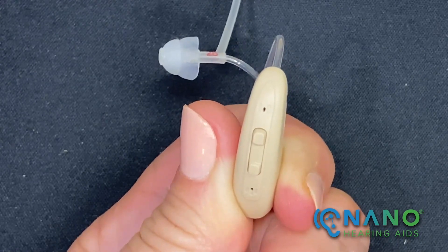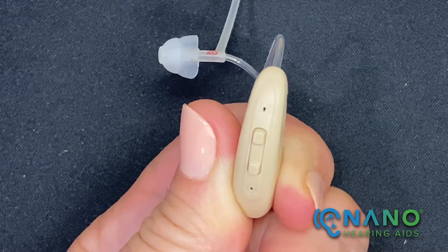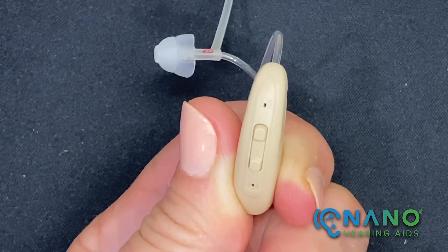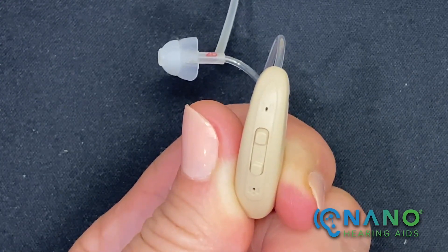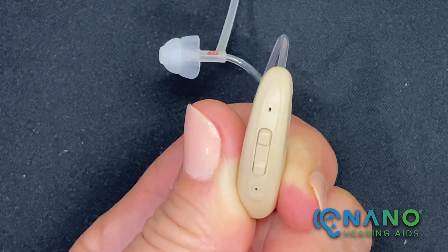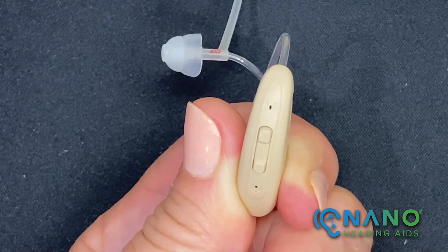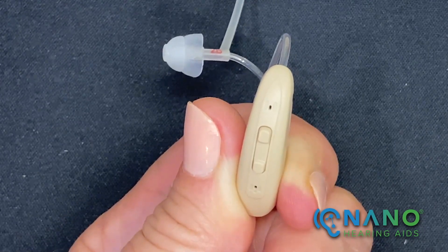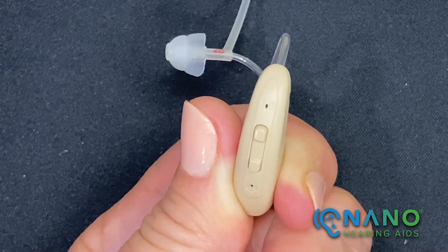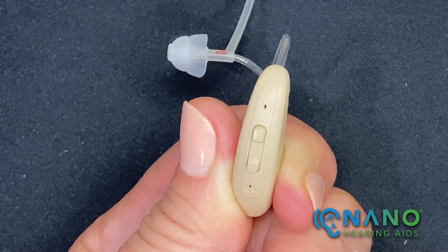Your hearing aids have four programs from which to choose. Programs allow you to change between different listening settings by shaping the sound differently in each setting. Take time to switch between programs to determine which best suits your comfort and listening needs. You may find program 1 works best in a quiet environment, whereas program 4 works best when listening to music.